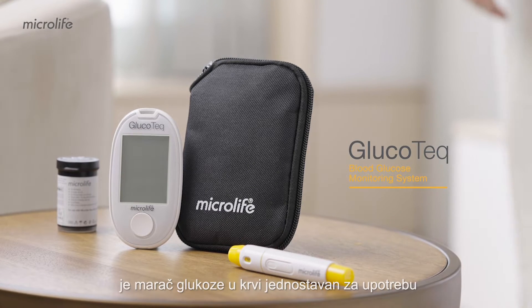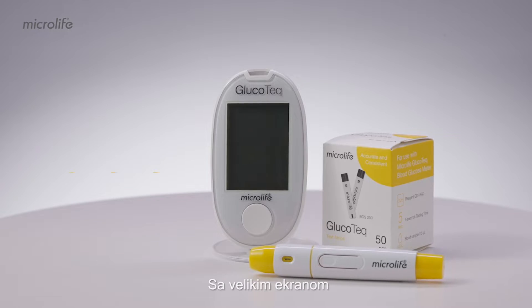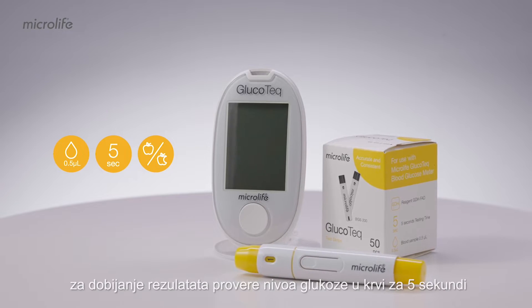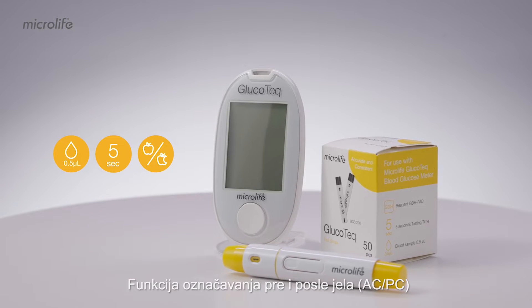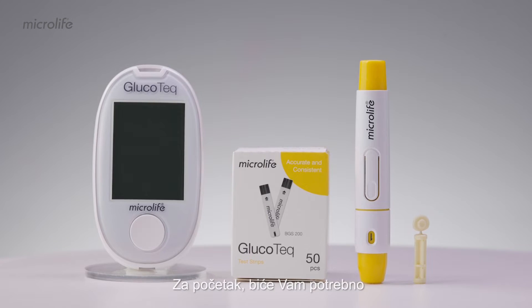The Microlife Glucotec is an easy-to-use blood glucose meter for checking your blood sugar level every day. With a large screen, only a tiny 0.5 microliters blood sample is required to achieve a test result of blood glucose level in 5 seconds. The before or after meal function, ACPC, makes the meter easy to use.